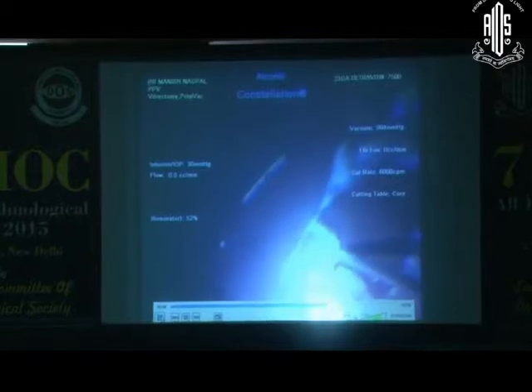Anyway, with that same linear incision further relaxed, I then go in with a high-mag view to see, because of this chronic traction, there's always some membrane or ILM-based traction which is also playing some role. You can see there's a definite thickened membrane or ILM tissue which is distinctly there and is coming off. All these components would help relax the central area. Because of this chronic traction, there's some component which is very stiff, and the radiating folds have relaxed to some extent.